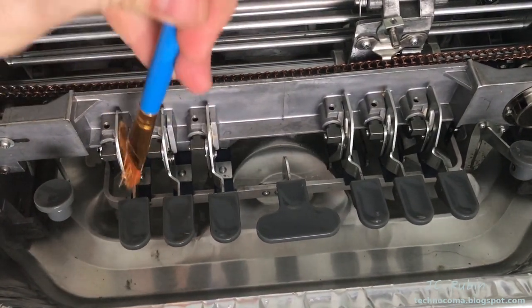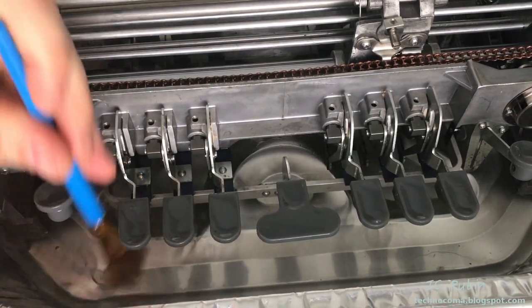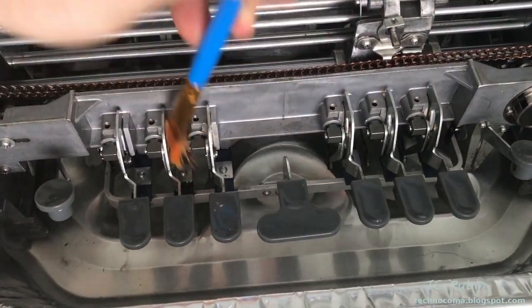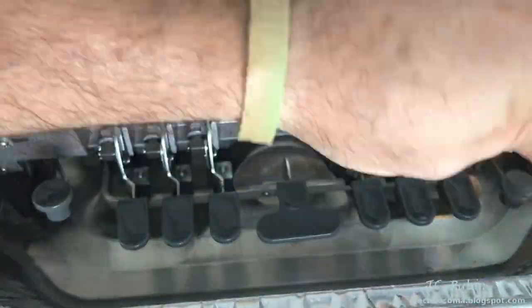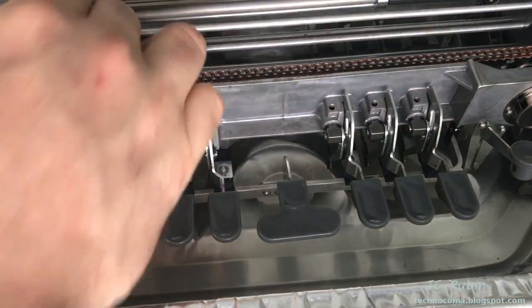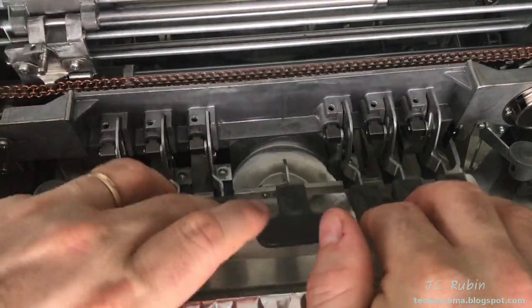Now working on the individual key slots where remnants of old grease had trapped a lot of dirt — doing them one at a time to get it all out. Then I press the keys a bunch of times to work everything in and distribute the solvent through the mechanism.